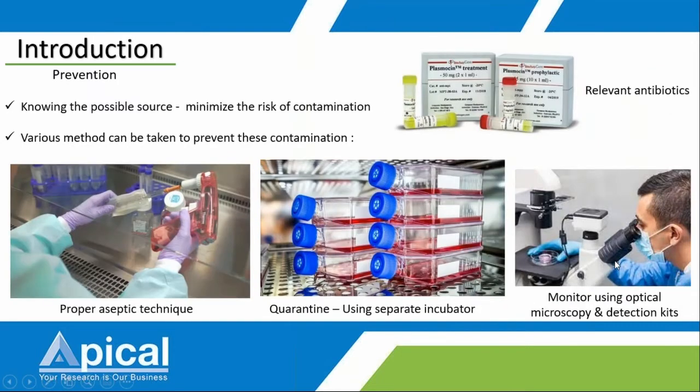So where do we start? It is always by identifying the source of contamination. Just like the wise man used to say, prevention is better than cure. When you know the source, you can actually minimize the risk of contamination. So how are we going to do that?